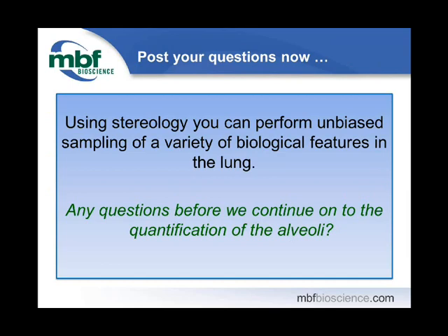And there's three ways that come to mind to think about this. You can search the literature, for instance, and if you see that someone has already done this and they write up good reasons for why they picked their section interval, why they picked how many sections to use, that's a good place for you to start. Another point is you need to be an expert in your region. So if there's some clump of cells in there that you never want to miss, don't make your interval so far apart that you might miss that clump of cells.